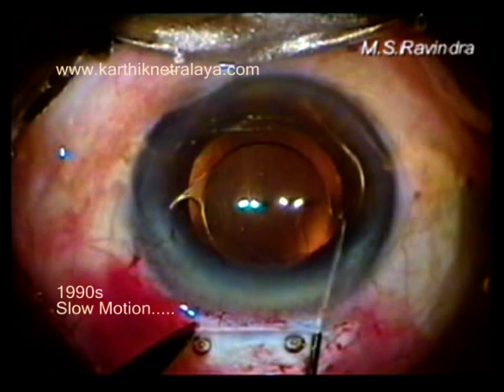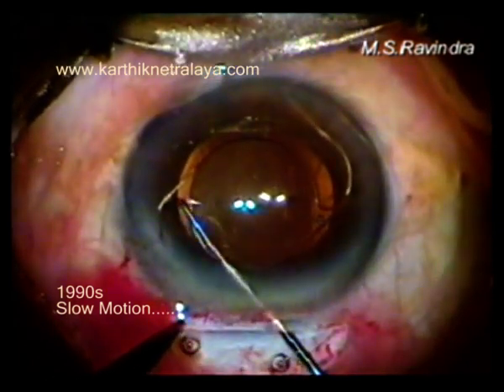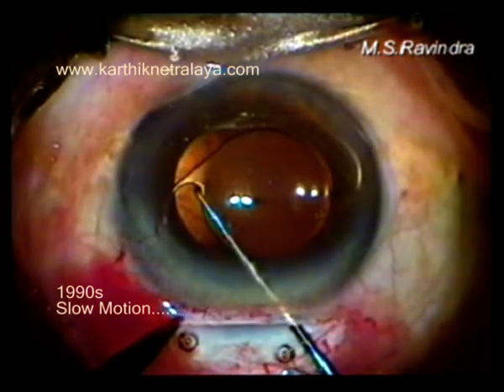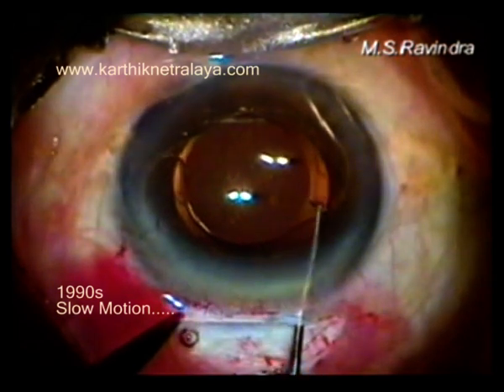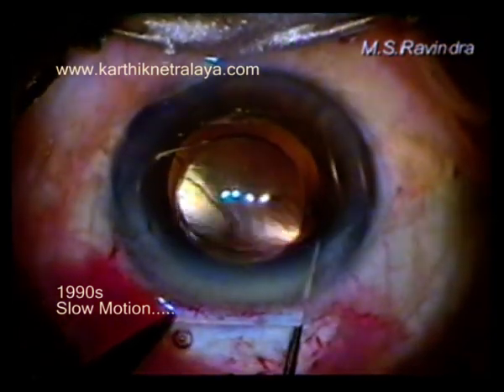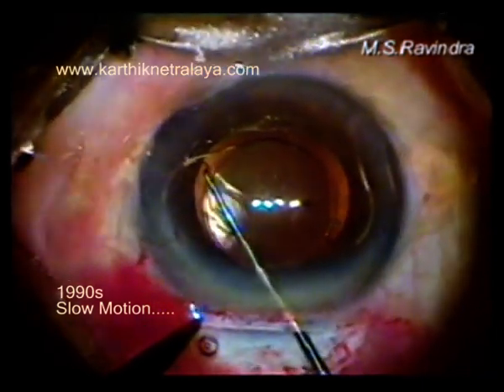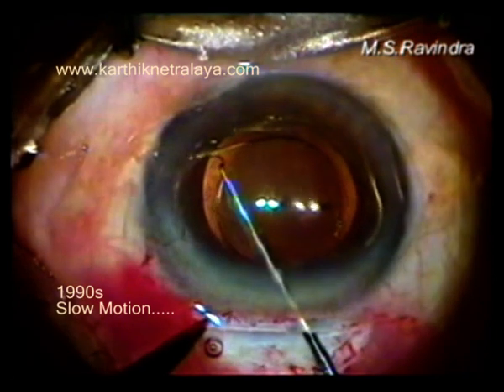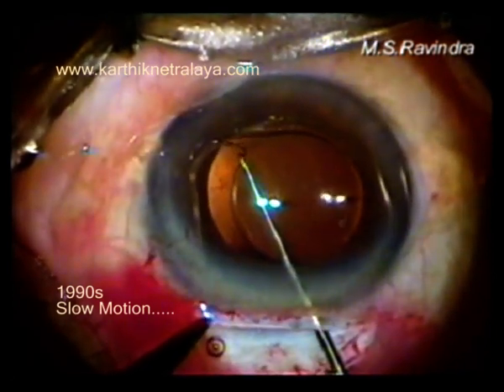I'm positioning it horizontally. When you position the AC lens horizontally, the pain somehow is not there — maybe because the lid presses the eye every time it blinks, and that pressure is conveyed to the lens and it hurts. By keeping it horizontal, that is totally avoided.